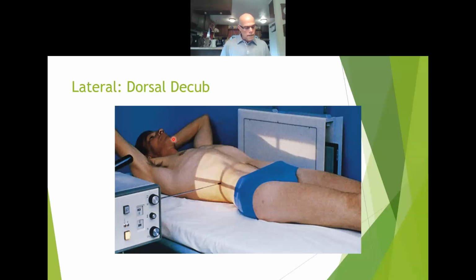All right. So now we're doing the lateral left and right dorsal decubitus. It says when the patient cannot stand or lie on the side, place the patient in the supine position on a cart or hospital bed with suitable support with the right or left side in contact. Again, your mattress will suffice for that.